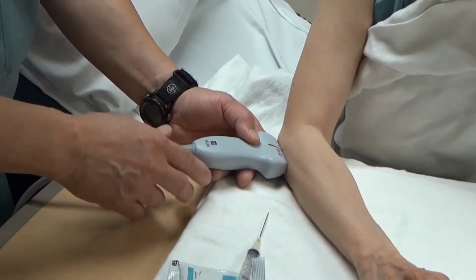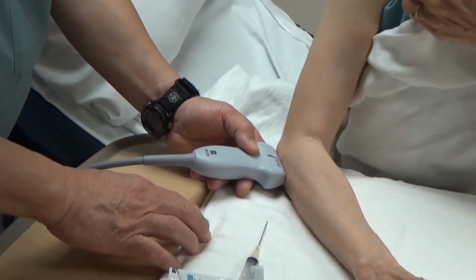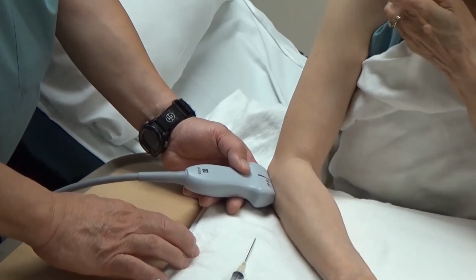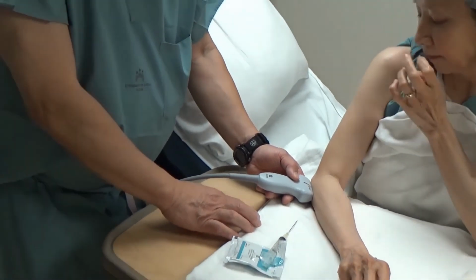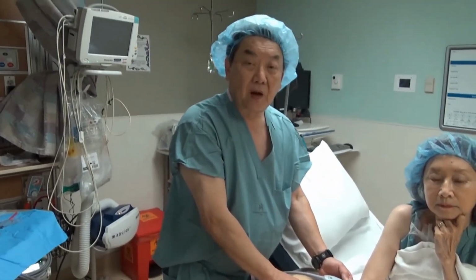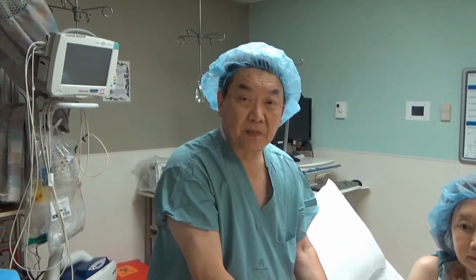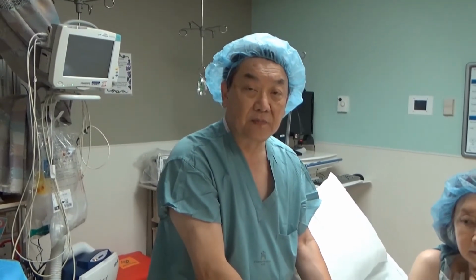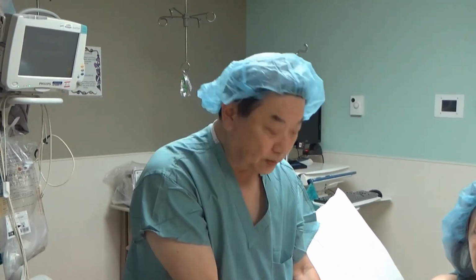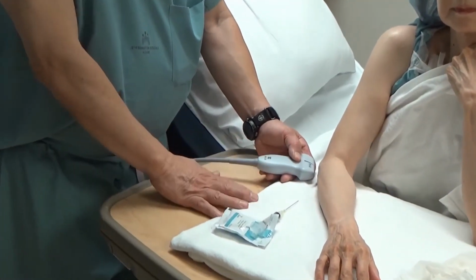So at the end of the procedure, you are advised not to inject corticosteroid. And the reason being that as a fenestration technique, we're trying to promote healing. And if you inject corticosteroids, you may actually delay wound healing. So we advise the patients not to take oral steroids or non-steroidal anti-inflammatories except for acetaminophen. Then once this is completed, we wipe off the skin, put a band-aid on, and that's the end of the procedure.